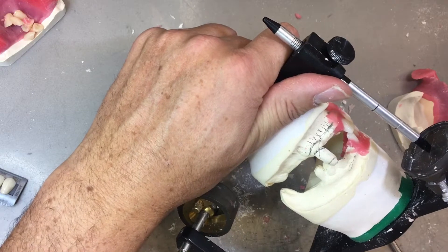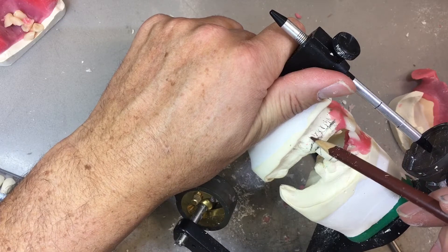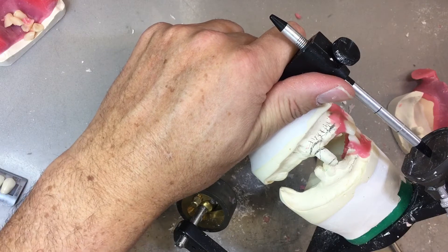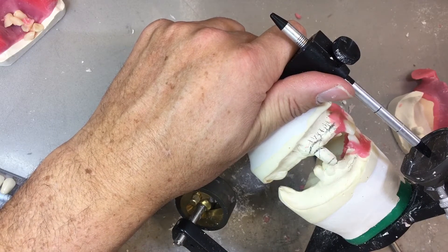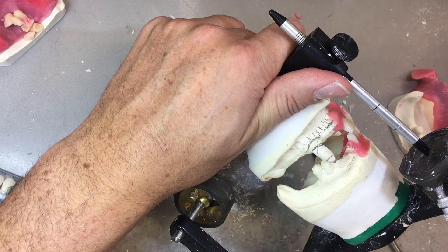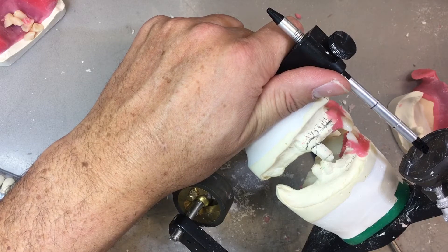There's no way this denture is going to go into the client's mouth if I engage all this hard bony undercut with acrylic. I don't want to run the risk that it's not going to go in the patient's mouth. So after processing, I'm going to get my burr — this is probably something we've never done, because we don't usually touch the intaglio surface of the denture. In this case, we're going to. We're going to use a visual surveyor — you could use a duplicate model, but it's a little overkill — and we're going to ream out the undercuts of the denture.